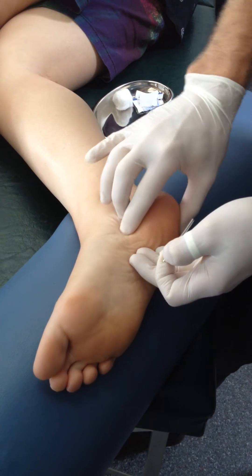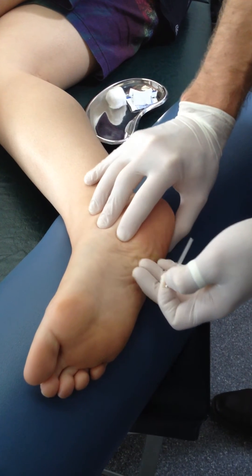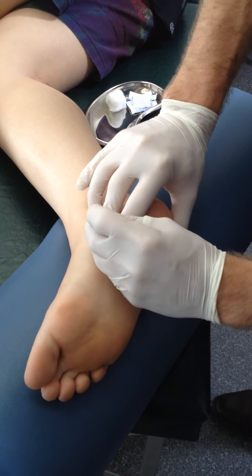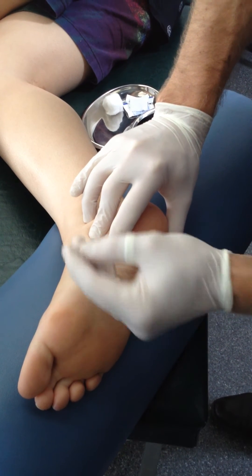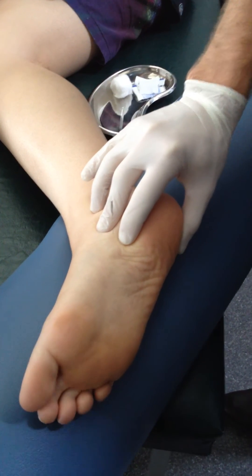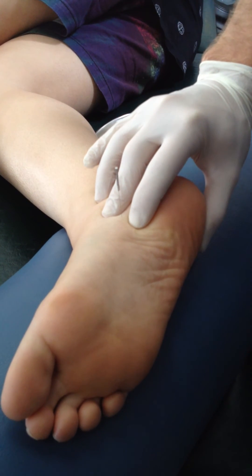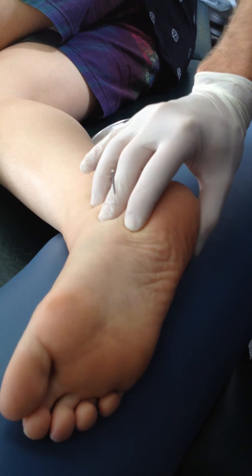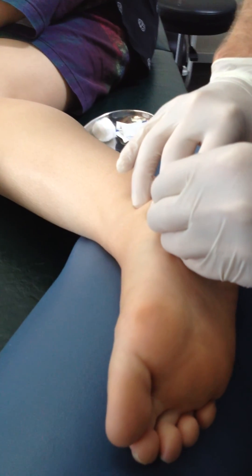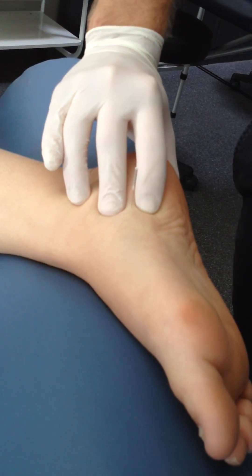Getting the needle in through the fascia and then seeing how the patient is going is generally my approach. I've found a location here — applying a fair bit of pressure with my fingers and with the guide tube. The medial side of the foot is generally a little bit less sensitive than the plantar aspect. So that's not there, that's not there.